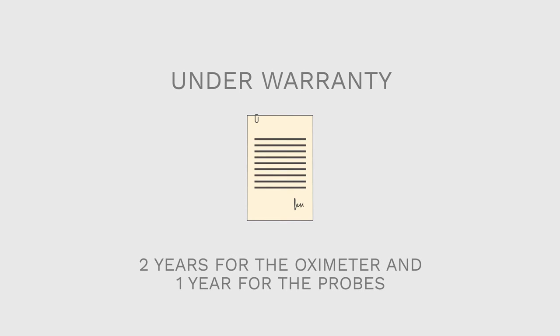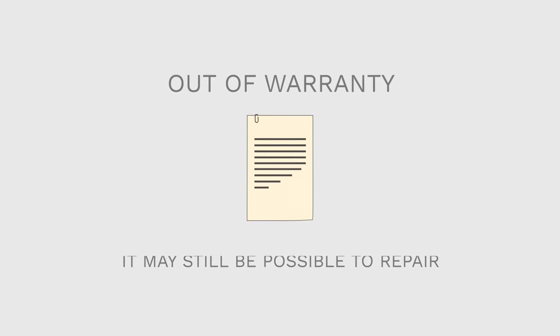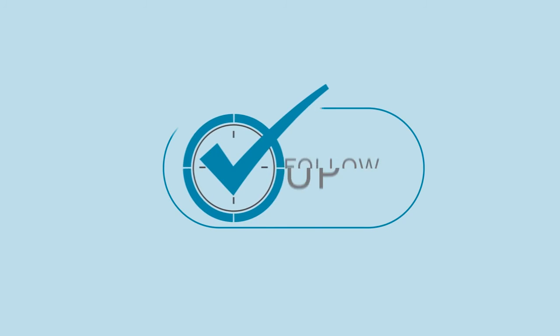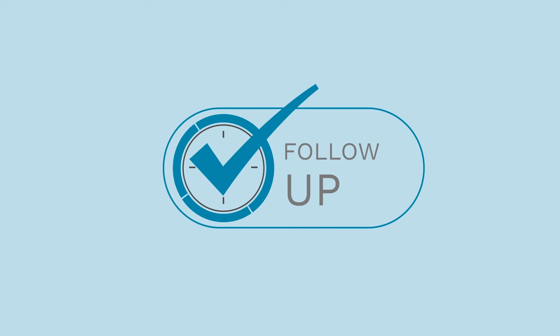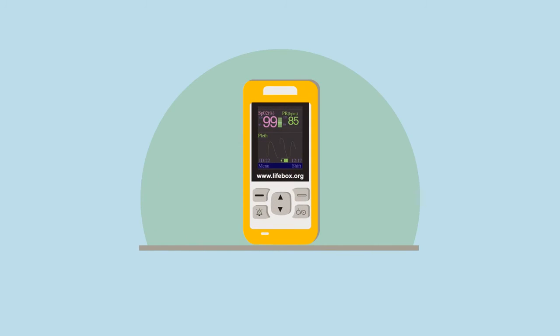The Lifebox oximeter is under warranty, 2 years for the oximeter and 1 year for the probe. If your oximeter is out of warranty, it may still be possible to repair it. Contact information is written on the side of the oximeter. Follow-up is an important part of the Lifebox Safe Anesthesia program. Someone affiliated with Lifebox will be in touch in the next 12 months to make sure that your equipment is functioning correctly. If you need additional oximeters, talk to your hospital director.